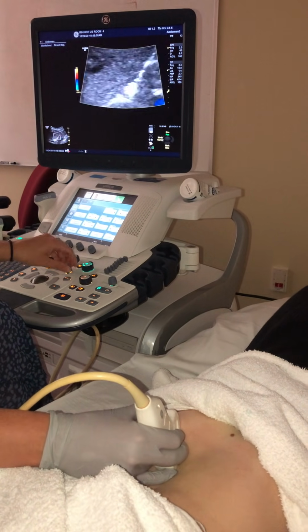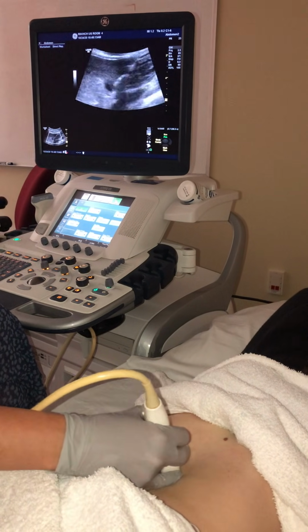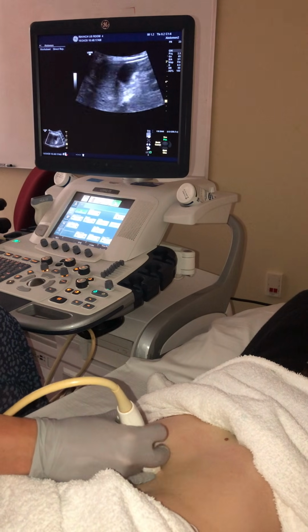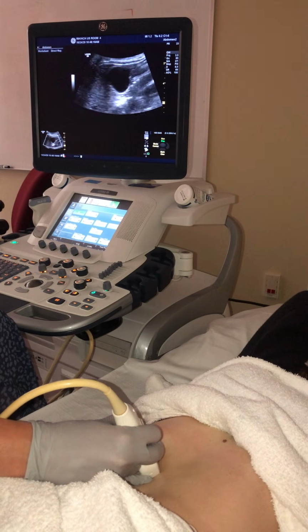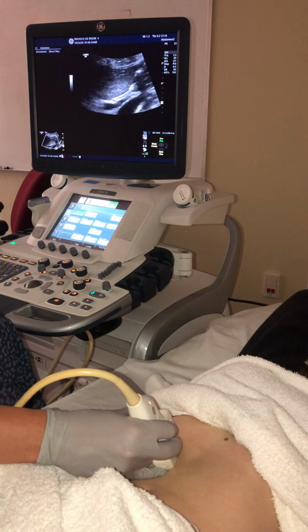So let's zoom out a little bit and kind of see what that general location looks like again. So we have our transverse gallbladder here. We're using that as our landmark. We're sweeping up slowly so we get to the porta hepatis.